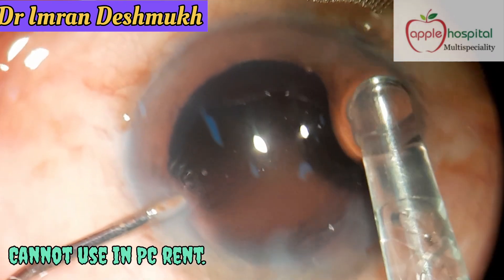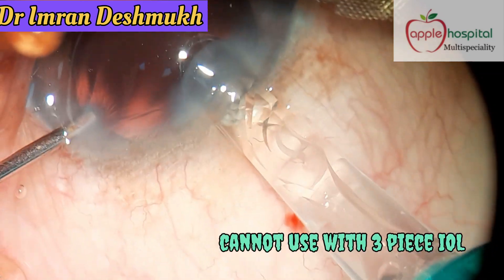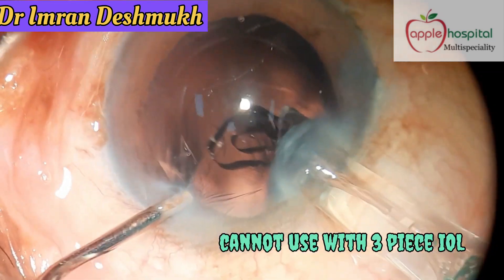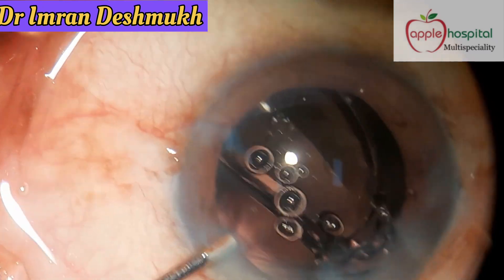There are some conditions in which you cannot use this technique: when you have a PC rent, when you have a runaway rhexis, or when you're implanting a 3-piece IOL. It is still difficult to place a 3-piece IOL with this hydro implantation technique.